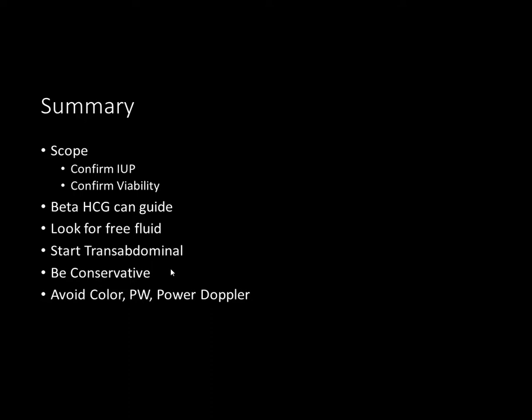This includes using scripts, counseling the patient prior to your scan about the scope, and giving them warning about your counseling before the scan is done. For example, I tell every pregnant patient before I do their scan, if they present with abdominal pain and bleeding, that regardless of what I find, and no matter how reassuring it is, I will likely diagnose them with a threatened miscarriage. This allows them to find comfort in the fact that I have not seen anything on my ultrasound that caused me to place that diagnosis.